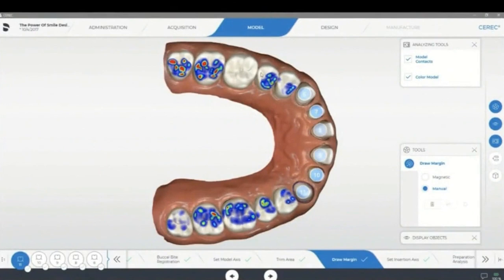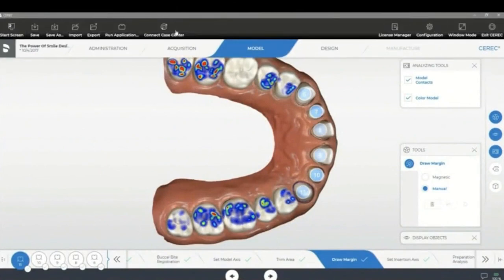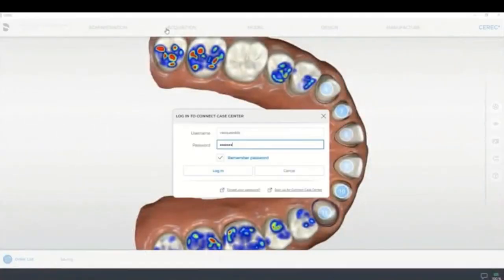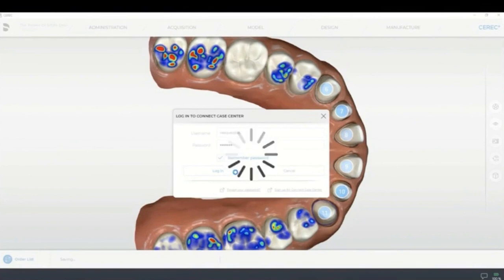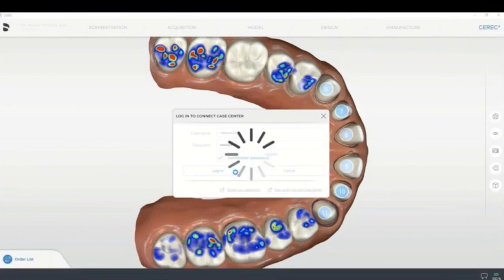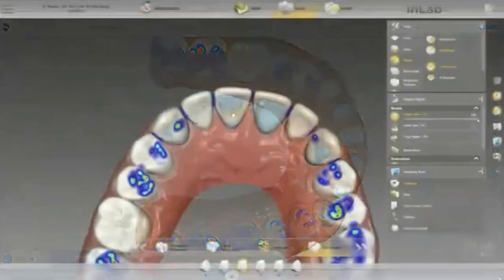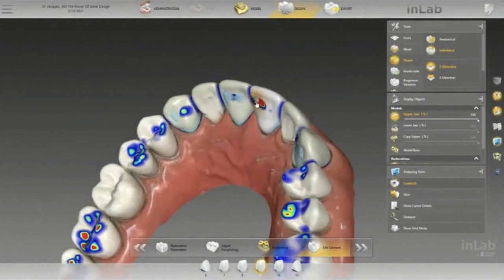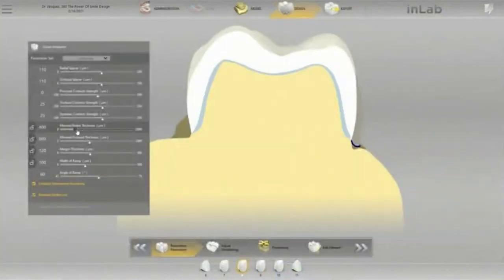And we are going to define our restorations right now. This is already in the software. We already picked the margins, and we're going to send this from the chairside software to the lab software, because we're going to need to print these restorations. Once they are in the lab software, we're going to decide. Now, very important.